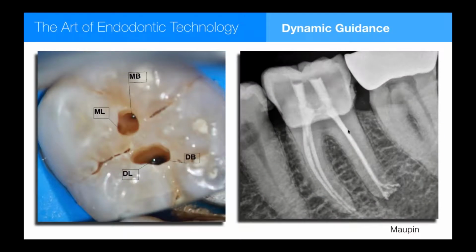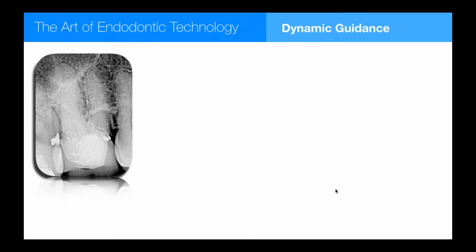We look at all these really talented endodontists doing minimally invasive endodontics, and what I see is really small coronal shapes, small access openings, and almost never do I see the 3-dimensionality of his treatment. Obviously, Charles does a lot of irrigation before he fills the canal system, but that whole challenge is changing as we speak. That's the last topic we're going to approach.